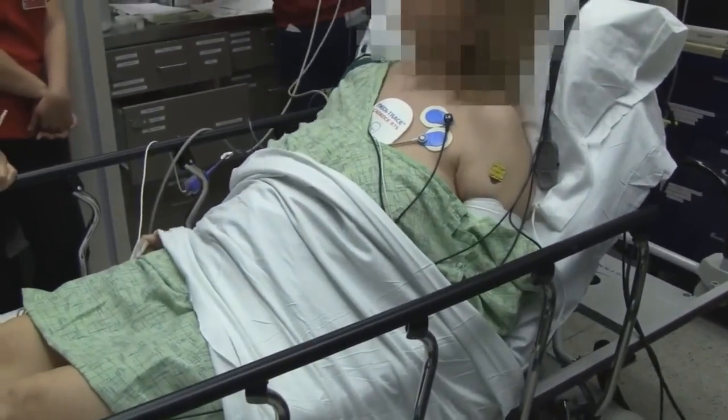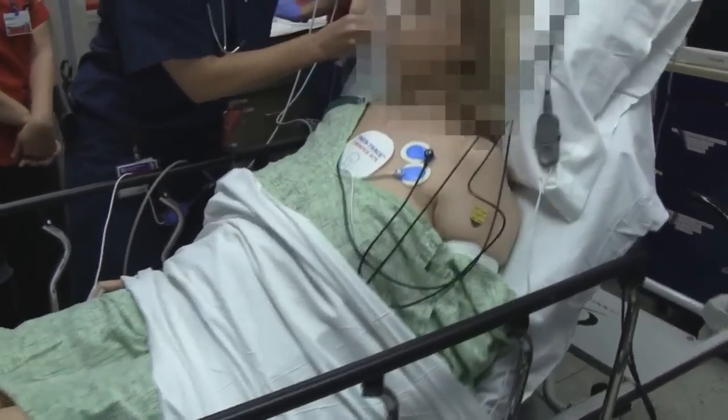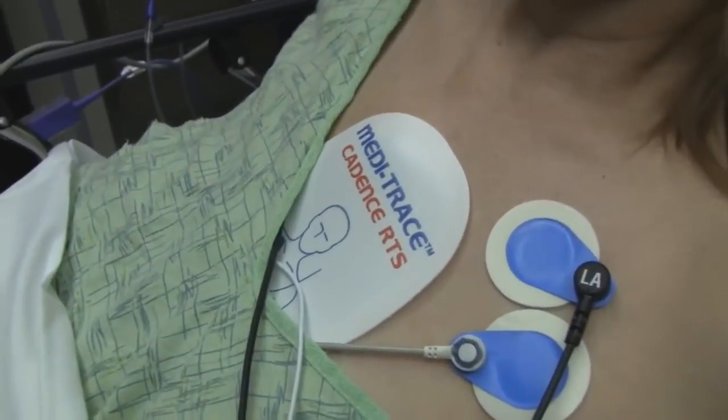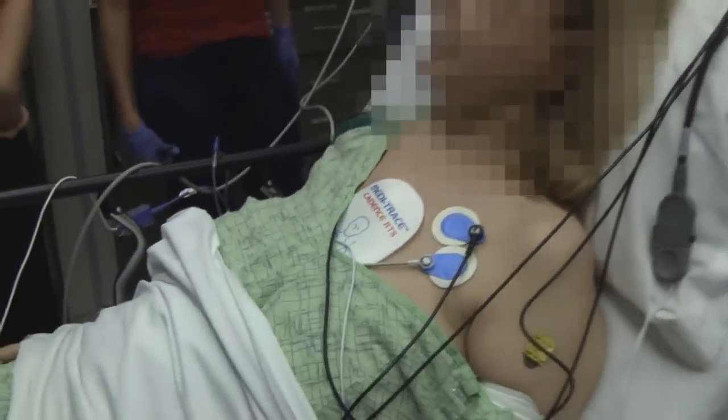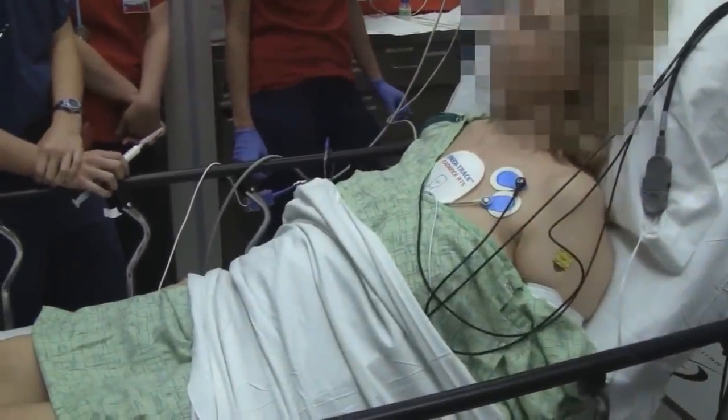How do you put your pads on — is this anterior or posterior? This is a typical anterior-posterior location. Occasionally we'll do side to side. And that tends to work best? It depends on the body habitus. But for someone with her type of body habitus, this is a very acceptable pad location.